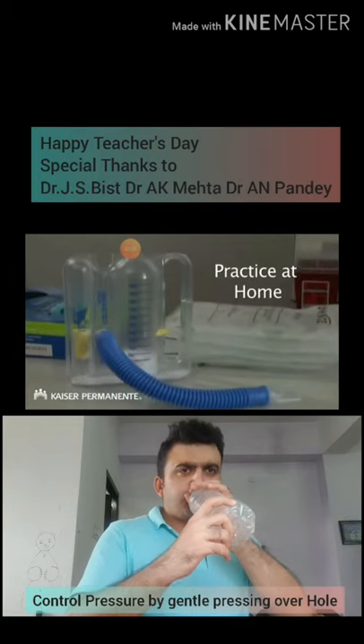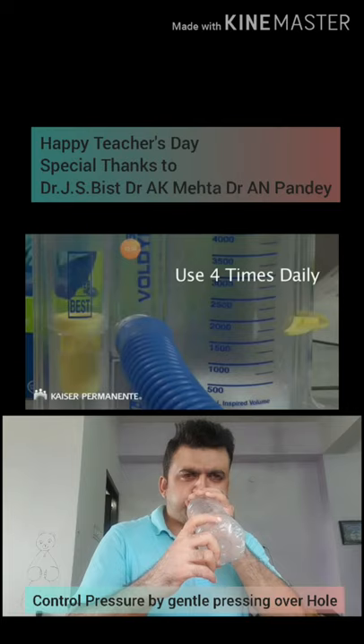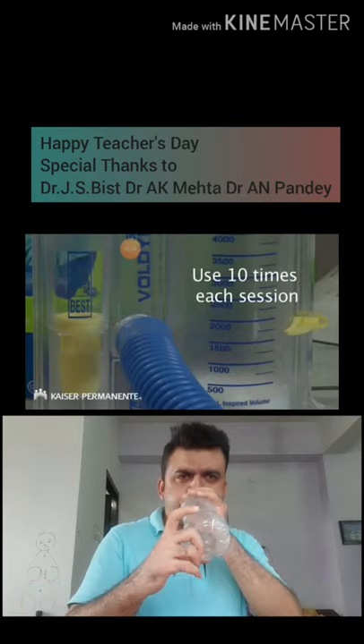Try practicing at home to get your lungs ready for surgery and help prevent pneumonia. We recommend that you use your incentive spirometer four times a day, inhaling ten times each practice session.